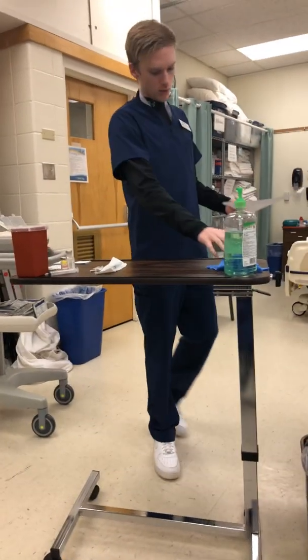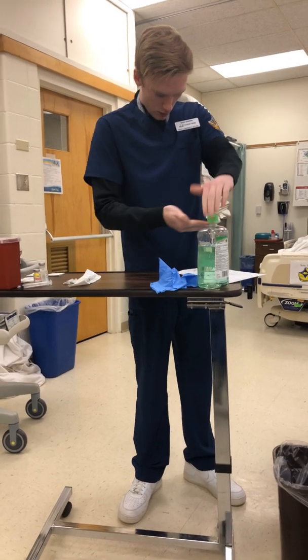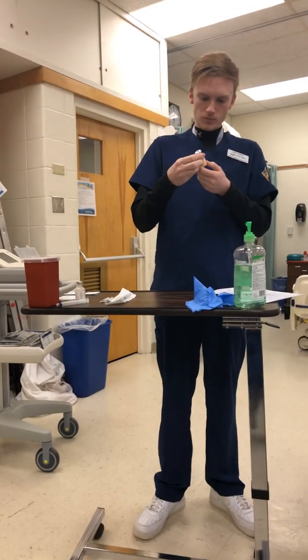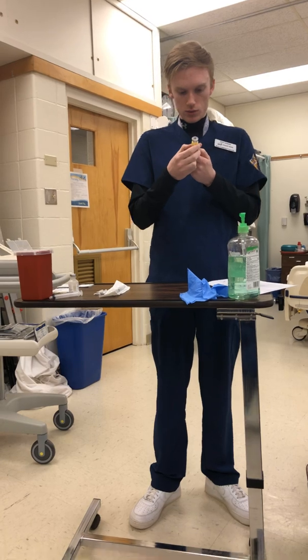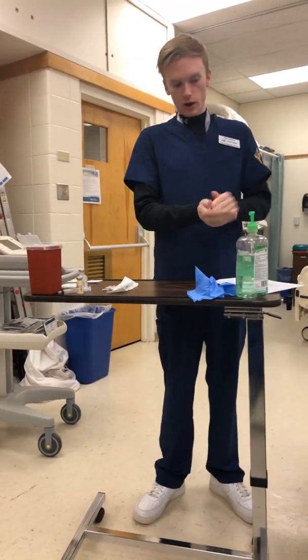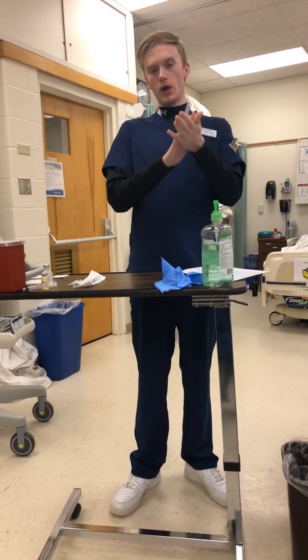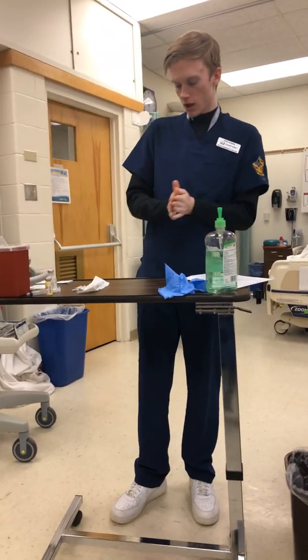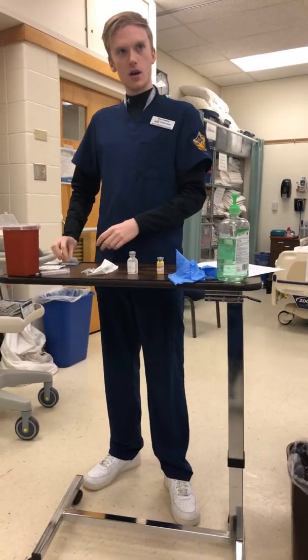So now we're going to come over here to the med room, and to recalculate the dosage according to the vial right here, we are going to use 5.6 milliliters of diluent to get 500 milligrams per mil. So we are going to be drawing out 2 mils total to meet that 1 gram requirement, or 1,000 milligrams. Now for that, we are going to begin. I just washed my hands again. We are going to clean the tops.